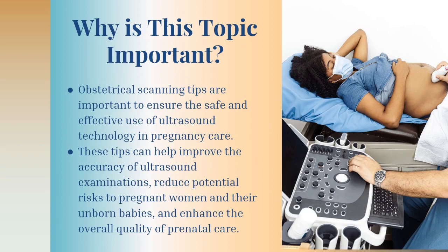This topic is important because obstetrical scanning tips are important to ensure the safe and effective use of ultrasound technology in pregnancy care. These tips can help improve the accuracy of ultrasound examinations, reduce potential risks to pregnant women and their unborn babies, and enhance the overall quality of prenatal care.